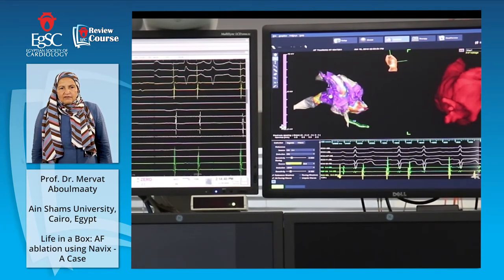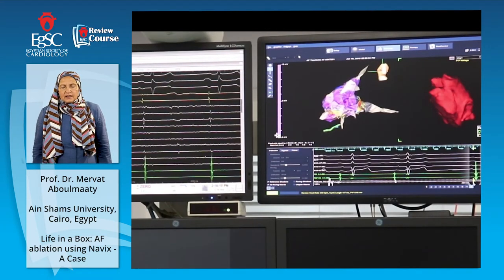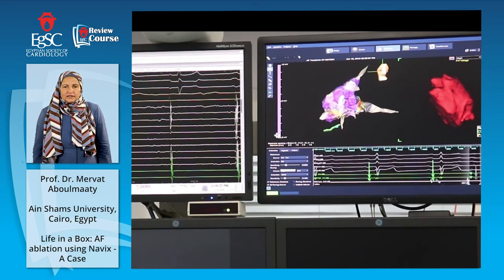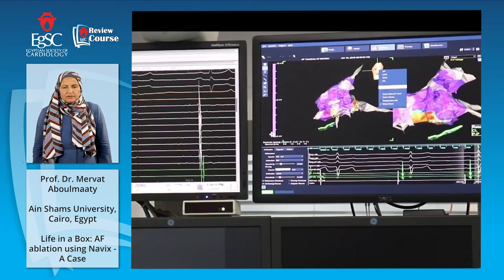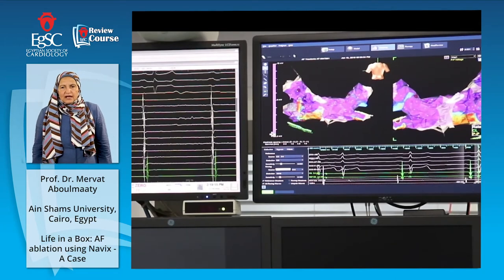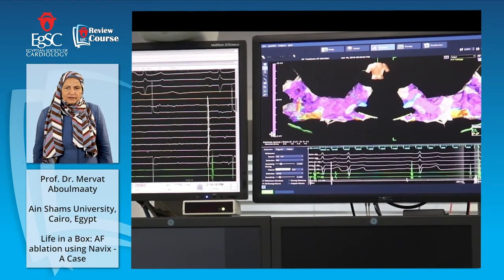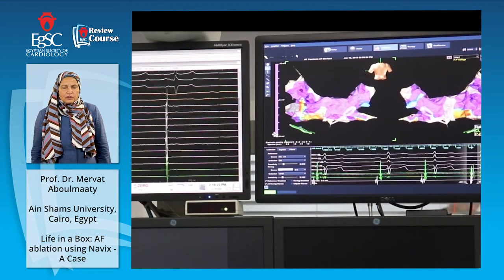Rechecking of what I have. As you can see, some potentials are seen from the site where the circular catheter is placed. Sometimes you can induce AF while you are moving inside the atrium. Now, when I'm finished with the map, I take off the CT image, and I can use two views in the same screen, and I pick the proper view for all the study.